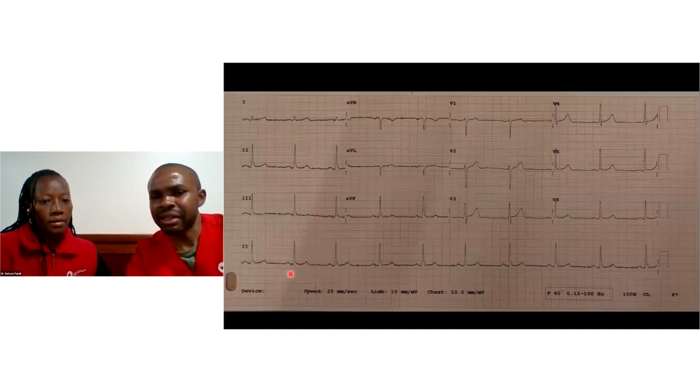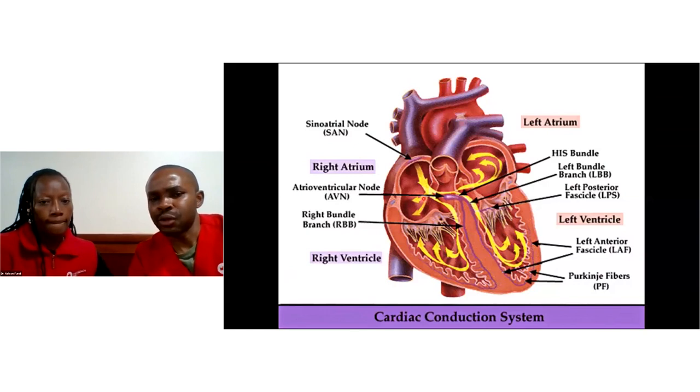Yeah. And the other thing I understood from you is, so the current has flown from here, it has contracted, it has given us a P wave.